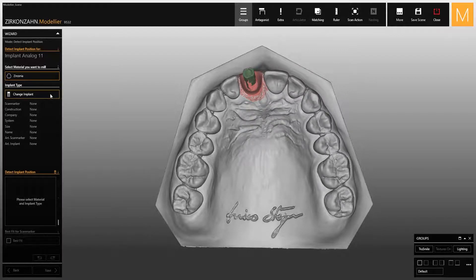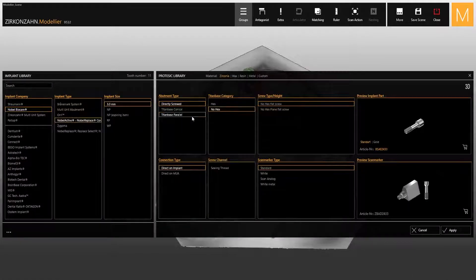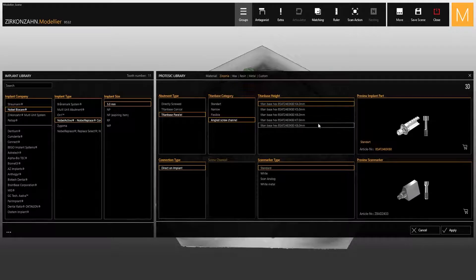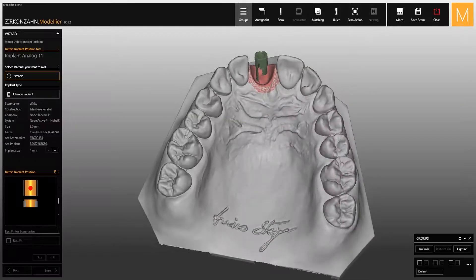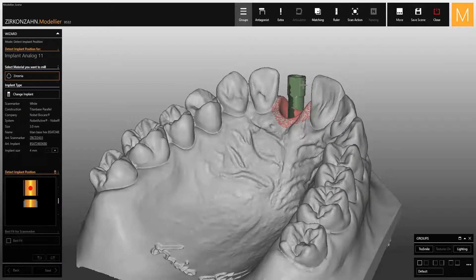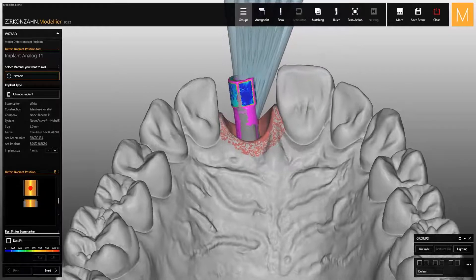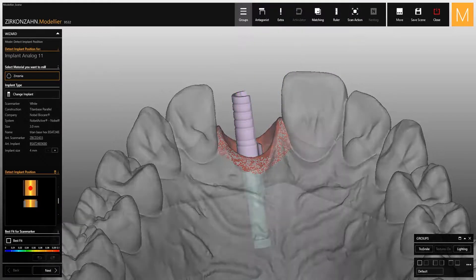If you open the implant library, you will find the new K80 bases with the different available heights. Select the desired titanium base, then proceed with matching the digital scan body to the scan of the physical one. At this point, all digital implant components, including the K80 base, appear on the model.